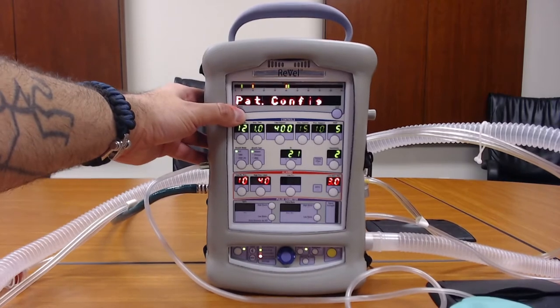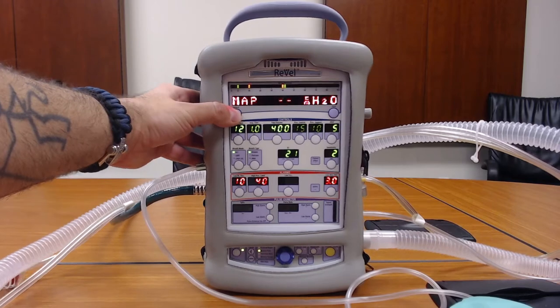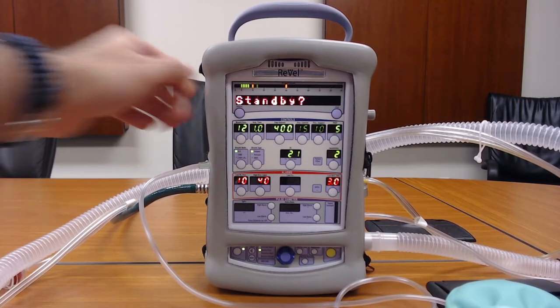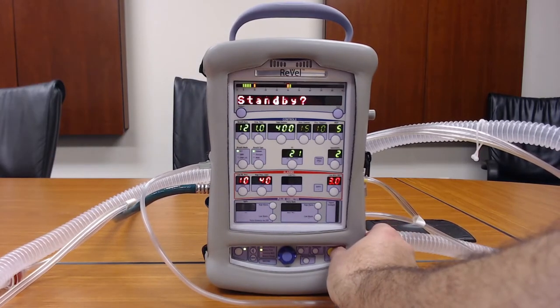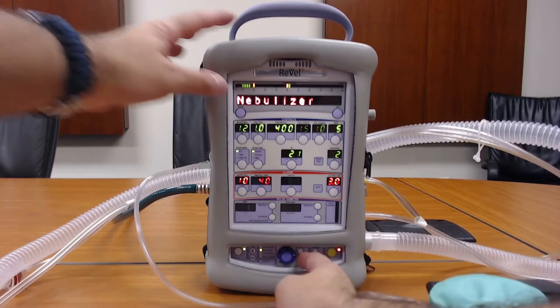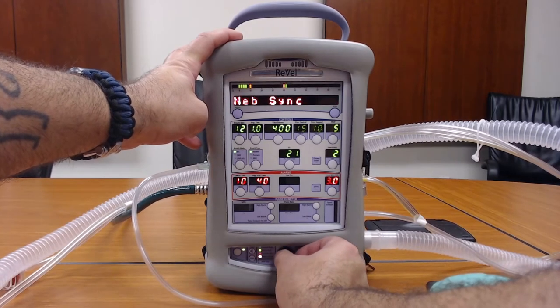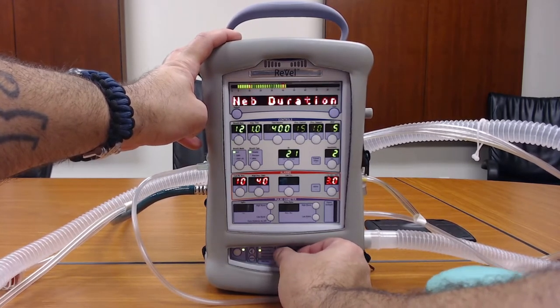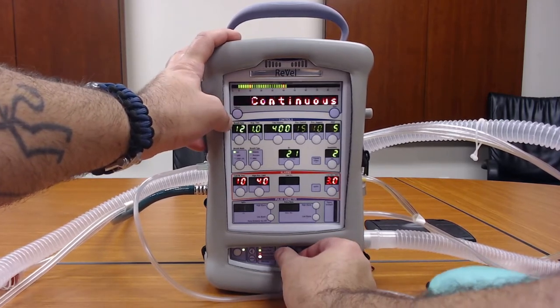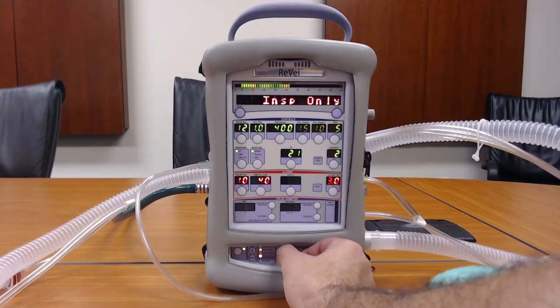We're going to go out of standby. To access the nebulizer, you have to go into the extended menus and go to nebulizer, hit select, and then you'll get four choices: nebstart, nebcancel, nebduration, and nebsync. If you go into nebsync, you have two options: continuous and inspiratory only.